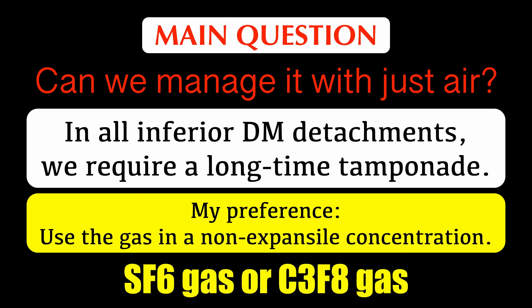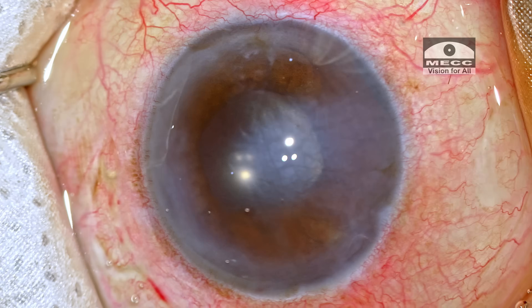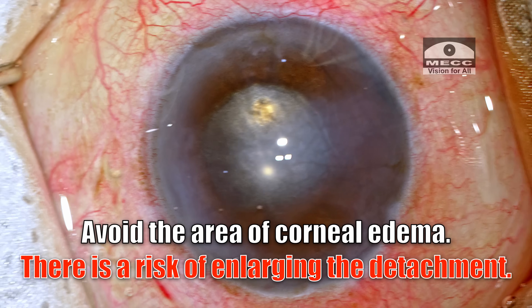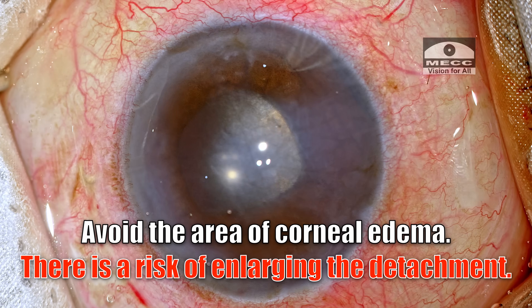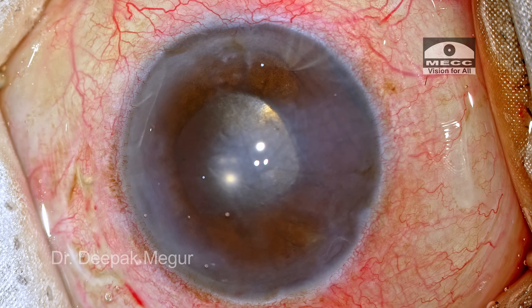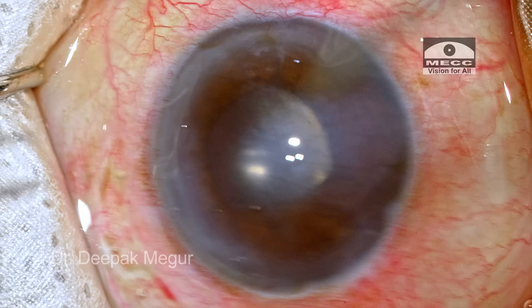In this case I'm going to use C3F8 because it was available to me at that point. Now, before I do anything, I would like to do the inferior iridectomy first, and choosing the location is critical. I would not want to go in the area where the Descemet's is already detached because that would carry the risk of enlarging the detachment. So I'm avoiding the area of corneal edema and going to the area just beside it.